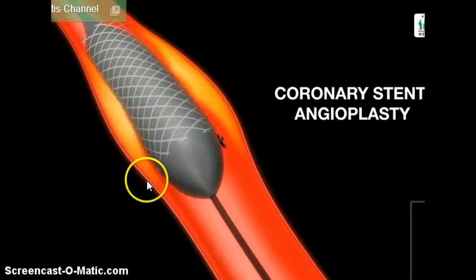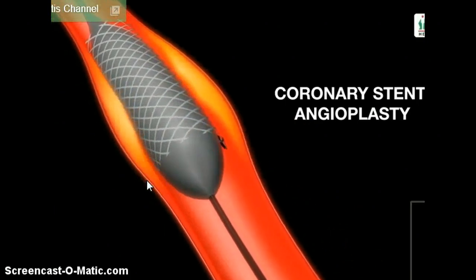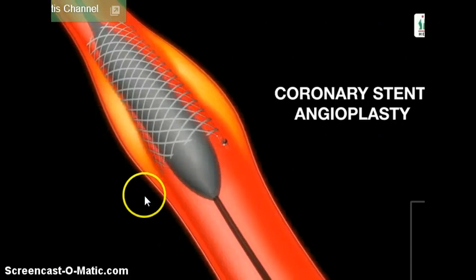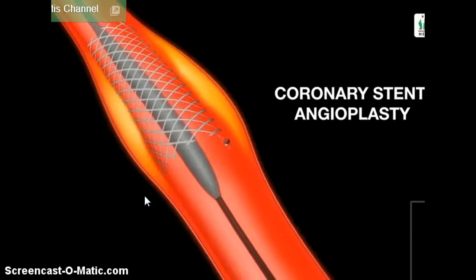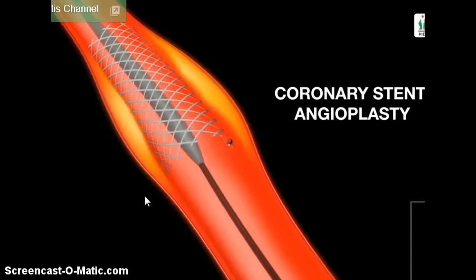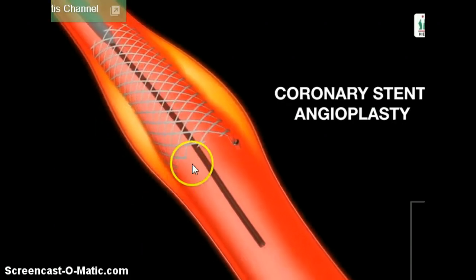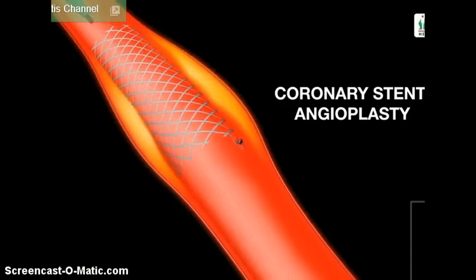That will expand the stent and deploy it. The balloon is then deflated and removed, and the stent stays in place.